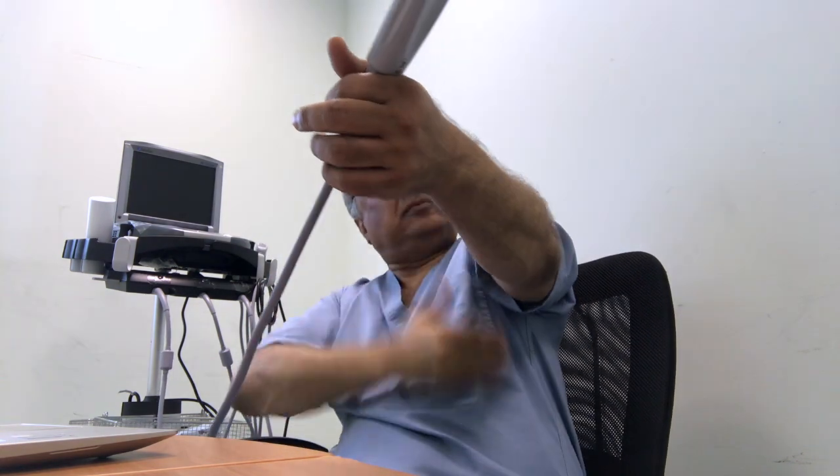On the lateral side of the axillary artery, identify the biceps brachii in the scan; it is above and the coracobrachialis lateral. Lateral means above. When we say above, it means lateral. The musculocutaneous lies in the coracobrachialis proximally and pierces through it distally, between the biceps and coracobrachialis. Deep to the artery means lower down, which means posterior. I discussed this with you.